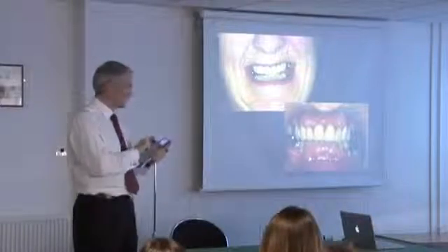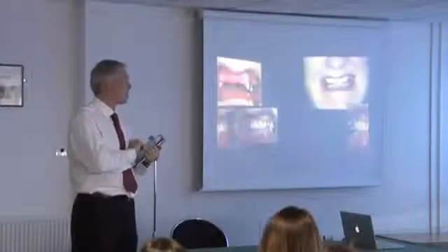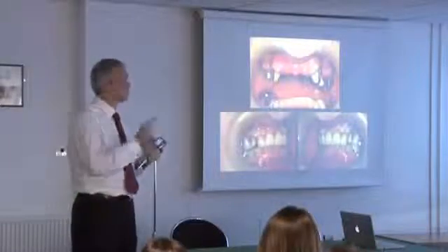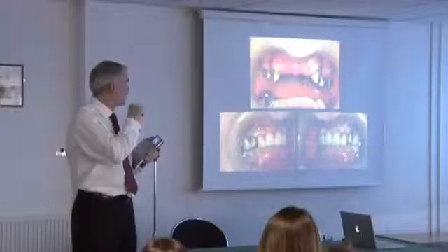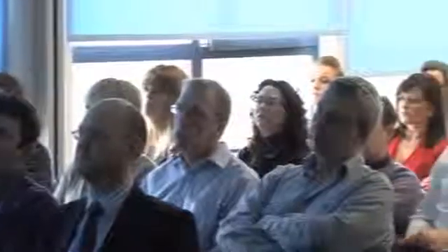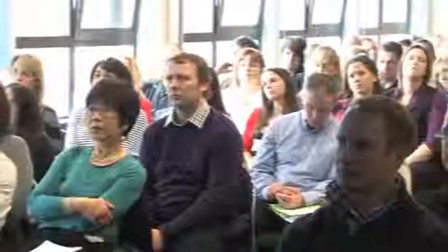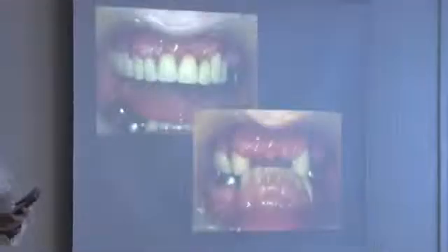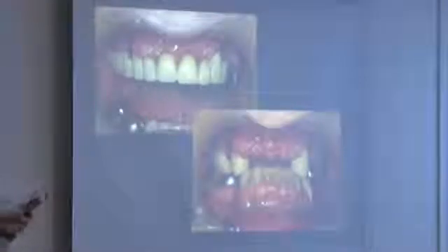So now I've done that, I'll have that converted into a denture, into a provisional. I'll then prep the teeth, and as you can see from the lower photographs, I'll use that provisional denture as my guide for prepping the teeth, which is where I'm keeping control. And at the end of this appointment, we're going to take the impressions. I'll then, furthermore, keep the denture in place and take my working impression through the denture. But then you say, well, that denture's not going to fit. But then I'll use my Tokuyama rebase and I'll make it all fit again, so it all comes together.